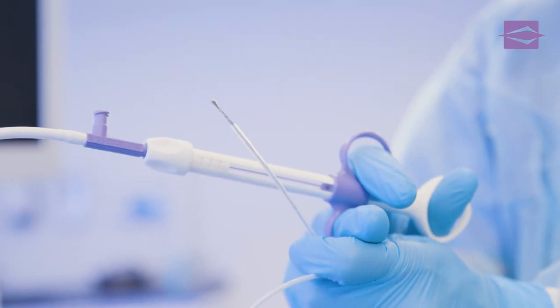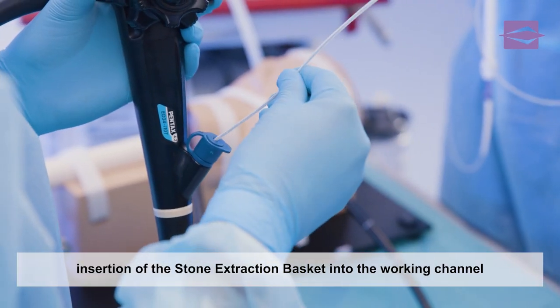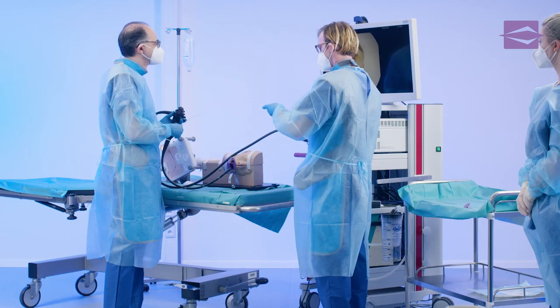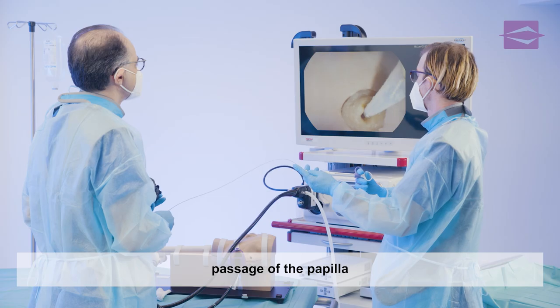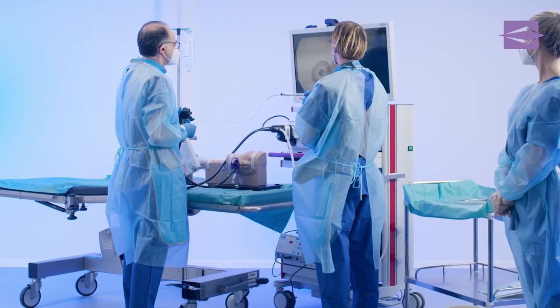The assistant hands over the retracted extraction basket to the examiner, who carefully inserts it into the working channel through the biopsy valve. Under monitor control, the examiner guides the retracted basket through the papilla into the bile duct. The stone to be extracted can be caught in a targeted manner, by looking at the x-ray monitor and by extending the basket from the tube.